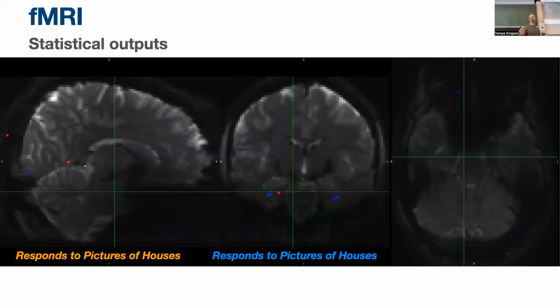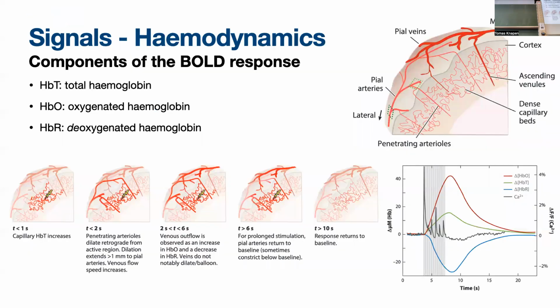The first then is to know what type of time course of signals to expect. And of course, the most important aspect that we then need to take into account, apart from when I showed that face and when I showed that house, is the shape of the hemodynamic response function, this thing that you've already seen pass by. We have this slow response that we know reflects this weird response of the vasculature that has to do with the deoxygenation of the blood. So it's this blood oxygenation dependent signal. And this is just to highlight the different phases of that response, even in the tissue.